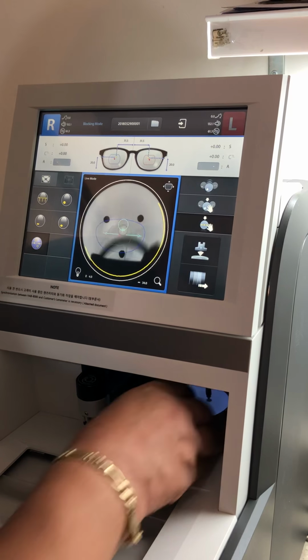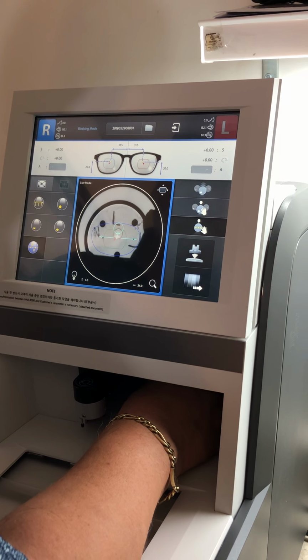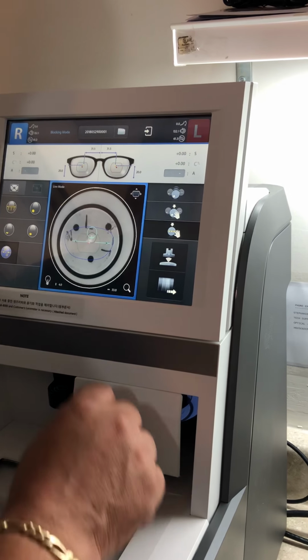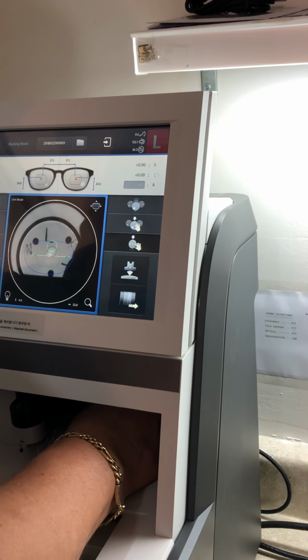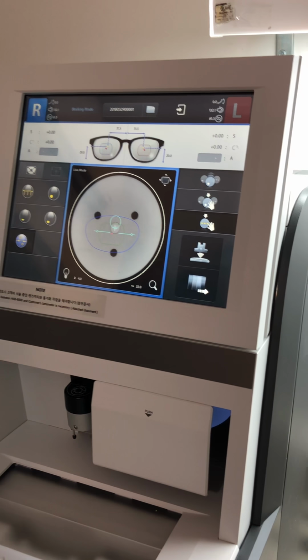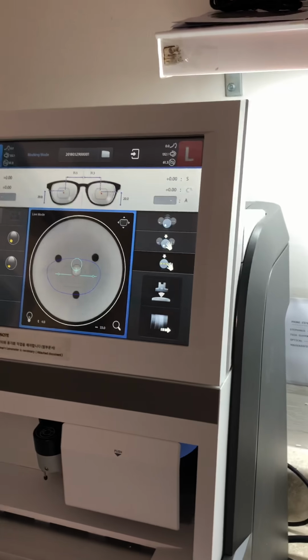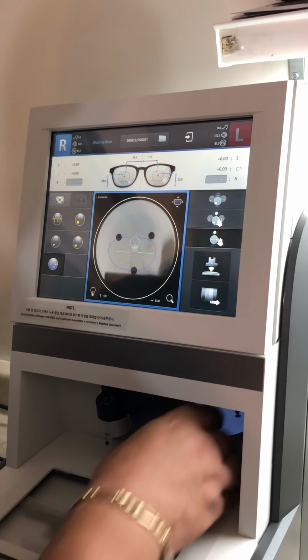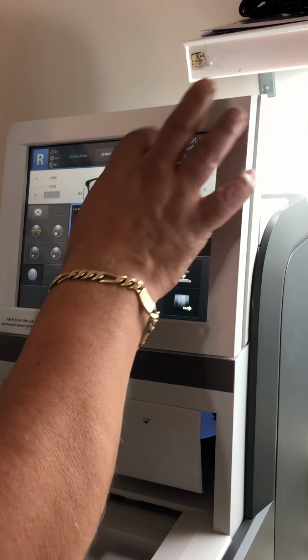So do you have another progressive? I just want to make sure they're all the same, because I can set the default, that's what I'm saying. Do you have another one of these? So now let's get up right there. Perfect. Cool. That's the only one? Are these all garbage lenses? Yes. I just want to see what the markings were on these. A little wider. Okay. Let's go ahead and change that.